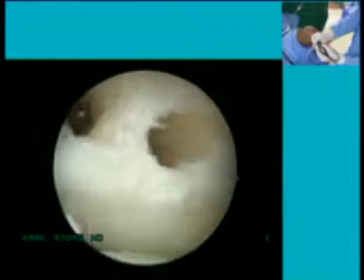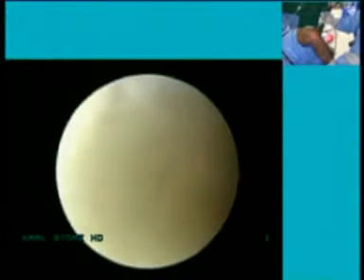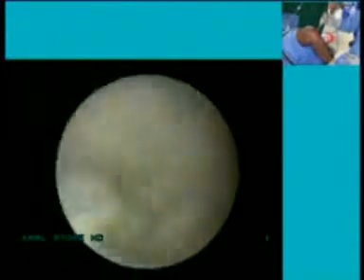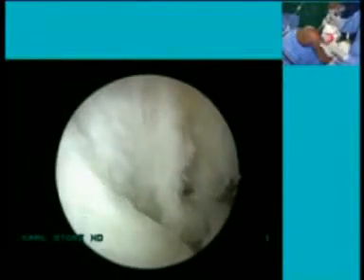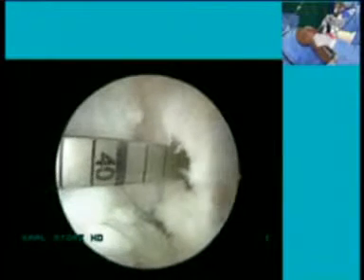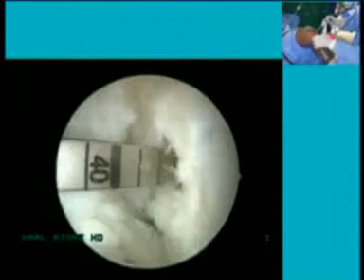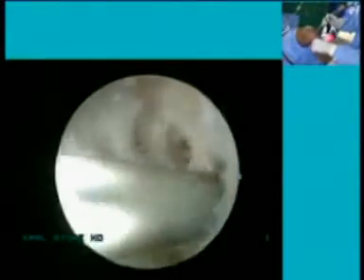Yeah, Dr. Wolf, please continue. We can see very nice tunnels. The owl's eyes are very clearly visible. Okay. And now I measure the length of the tunnels. What is the angle of knee flexion you are working in? 110. Okay. And now this is 34, the AM.